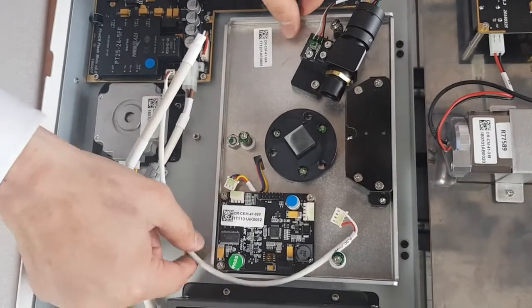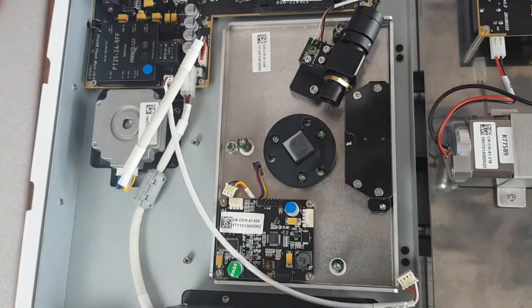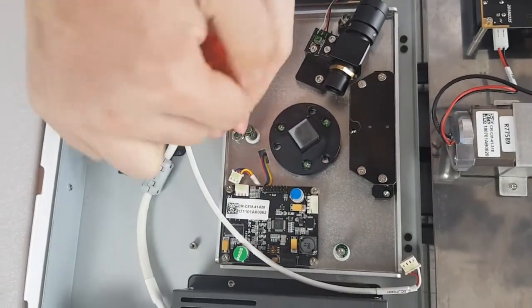So now just lift it. It's not ready — I'll loosen again.